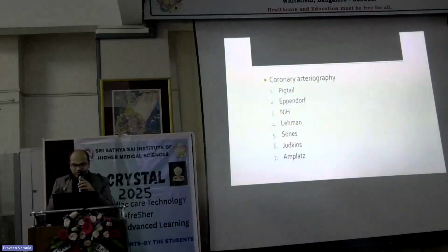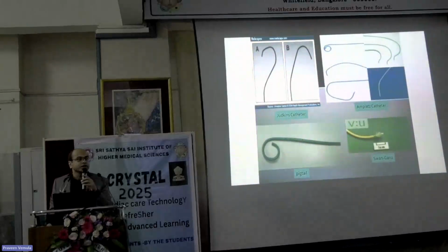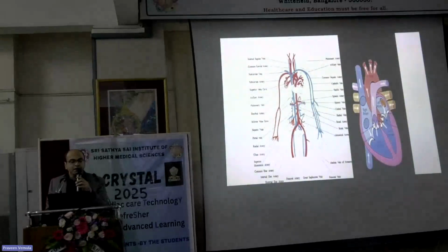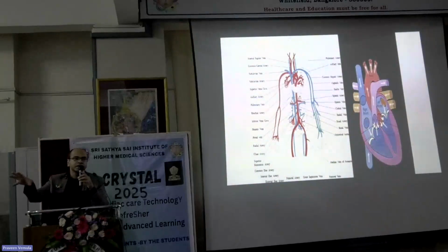Then, of course, some of it was already discussed by Silar. Arteriography, this has all been discussed. Some of those catheters are important, particularly the pigtail. They'll be asked to you. Spotters are shown. The right heart cath is simple. It has 2 parts, oximetry and angiography. Oximetry is taking oxygen samples from all of the chambers and the great vessels. You must finish this in 7 minutes.